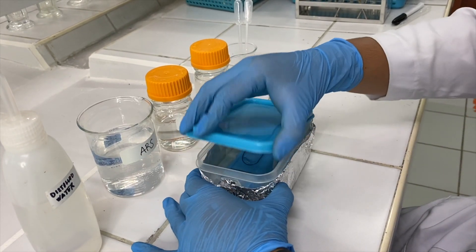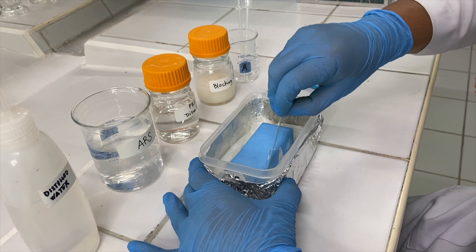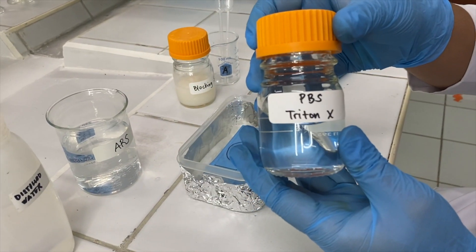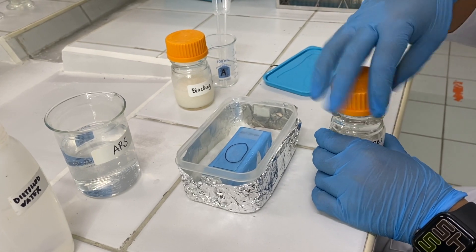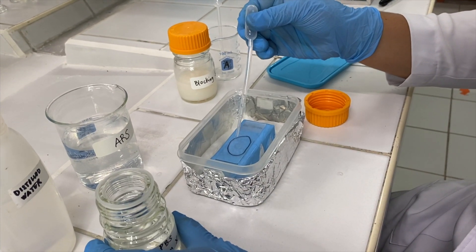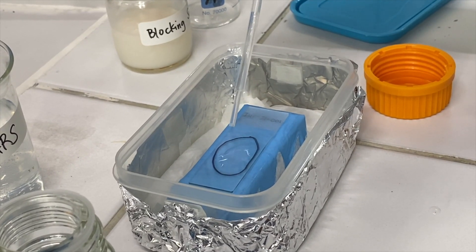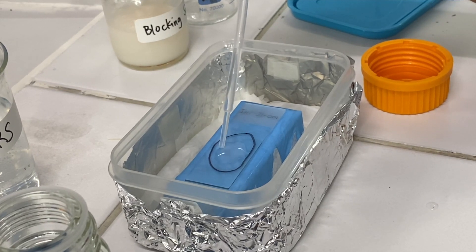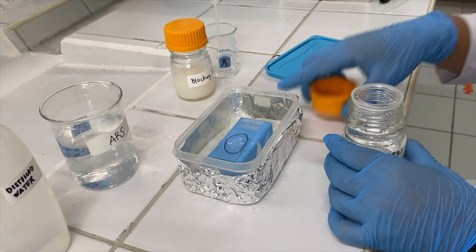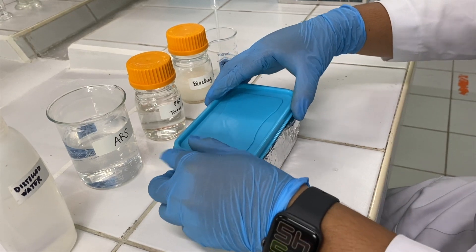Next, remove the ARS or the antigen retrieval solution and apply the next reagent, which is the PBS Triton-X. Ensure complete coverage of the tissue. Incubate it inside the chamber for 20 minutes at room temperature.